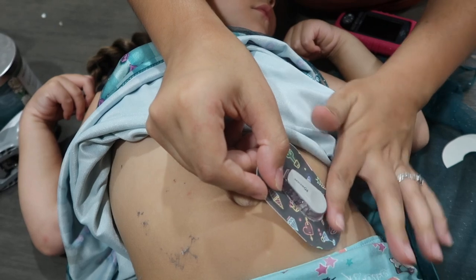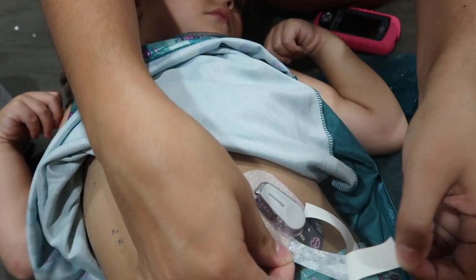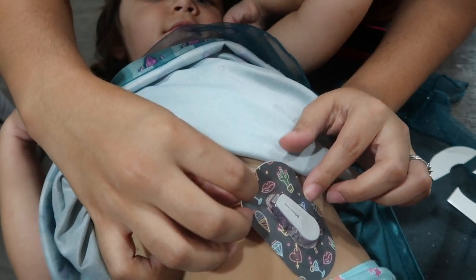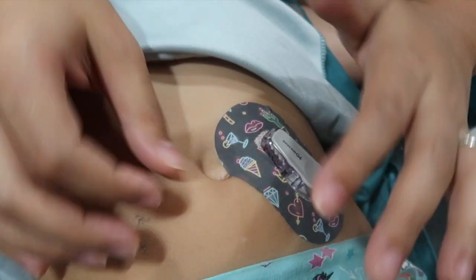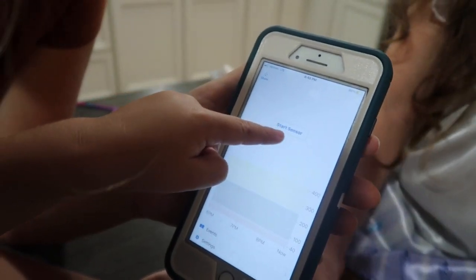Good job. Thumbs up. Is that uncomfortable? Yep. It's okay? Yep. It looks so pretty. Now let's press. Look. Put it down. It's okay. Press start sensor. Okay. Good job, yes. Mama. Now we can do pump changes.